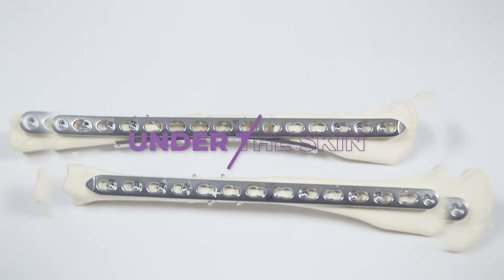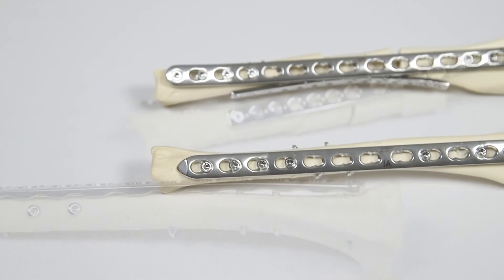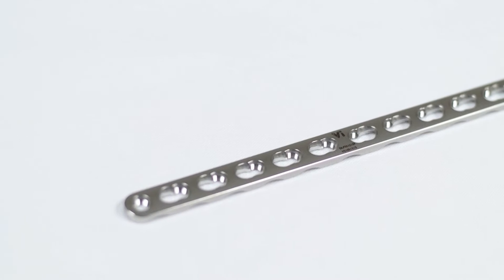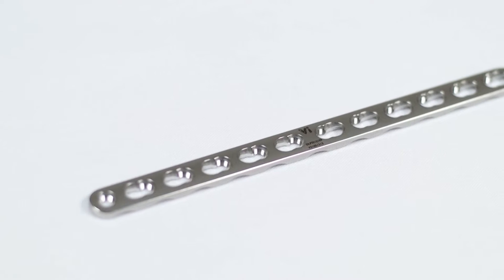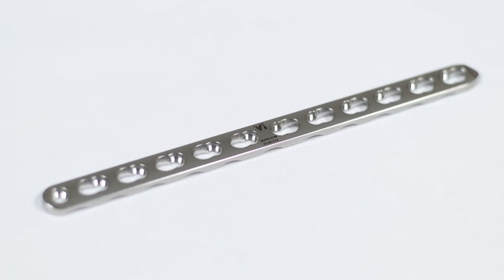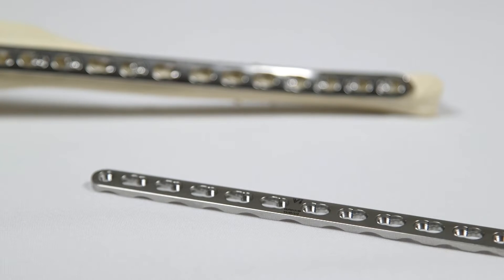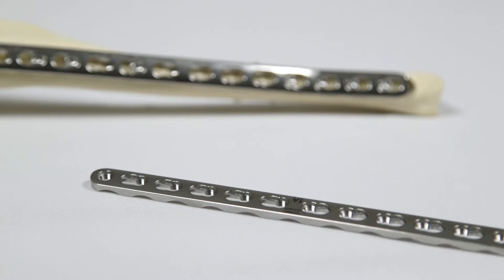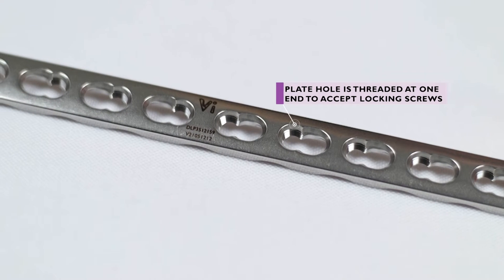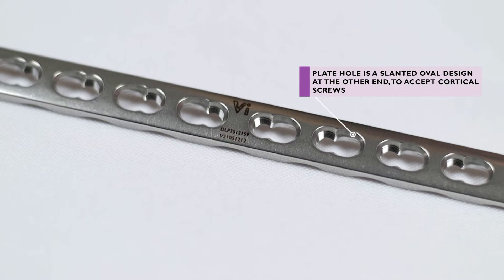Let's go Under the Skin. In this episode we are looking at how a dynamic locking plate, or DLP, is used in fracture fixation. A DLP, with its distinctive figure of eight shaped holes, can be used in numerous different ways depending on the type of fracture being treated and the desired surgical result. One end of the plate hole is threaded to accept locking screws, the other end is an oval slanted hole of the same design as a DCP plate hole.